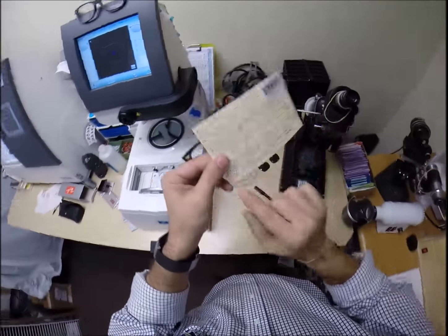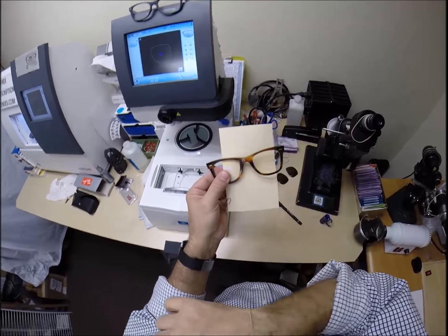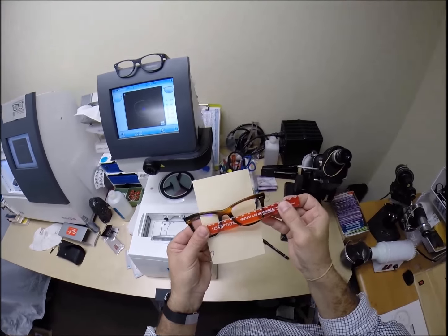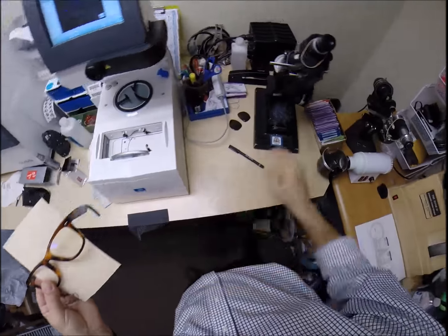Now your pupillary distance is 63. I'm going to turn the card around. Place the PD stick against my thumb on your right lens, and when we read it on the left lens, we're getting 63 millimeters, so that is cut perfectly.